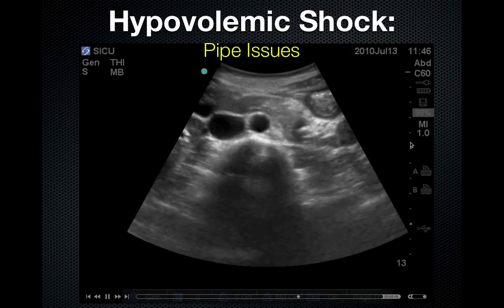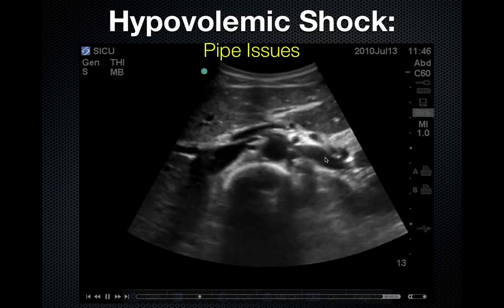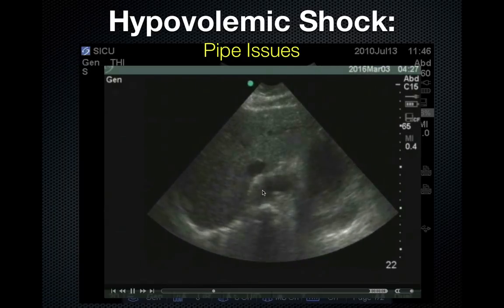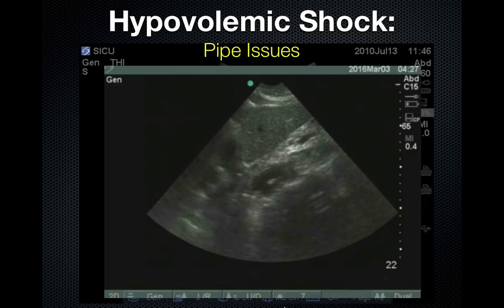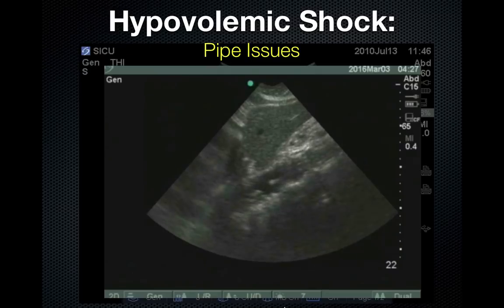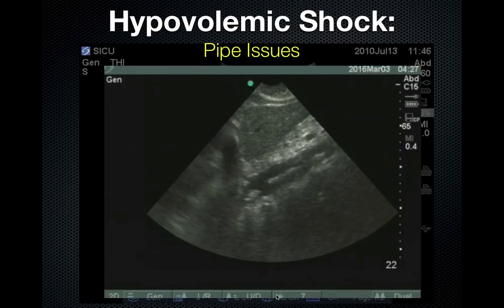We typically look for the aorta to be around 2 centimeters. Again, the centimeters are over on the side. Here are some examples of abnormalities. This initially was seen as some opacity inside the lumen, so when turning to a long axis, you can more clearly see that there is a flap throughout this aorta. So in the shock patient that you find this in, with the appropriate clinical situation, you know what to do.